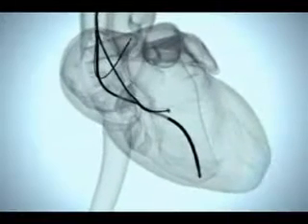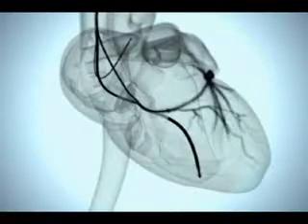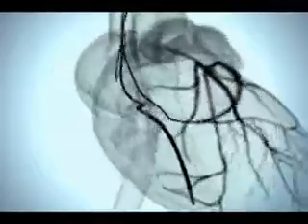This dye, shown on this x-ray image simulation, shows the picture of all the blood vessels on the left side of the heart that can be potentially used to insert the resynchronization lead.